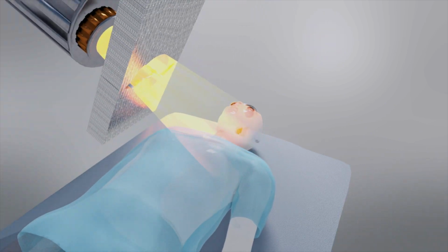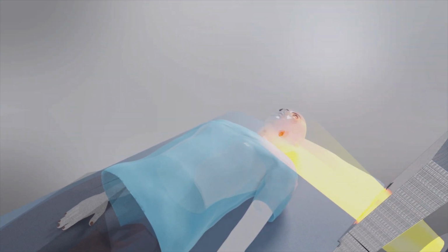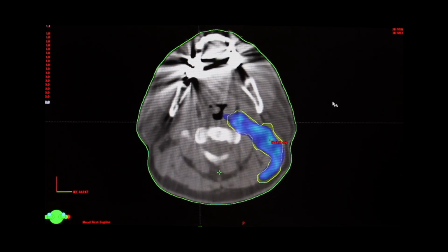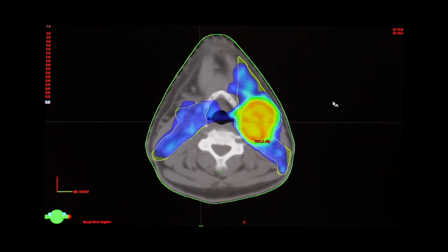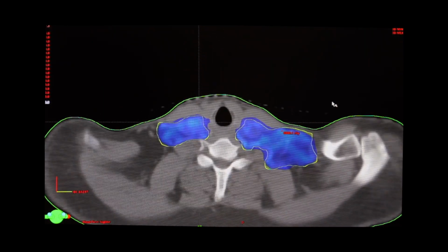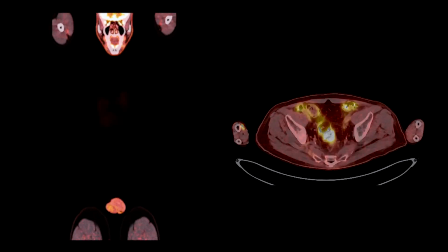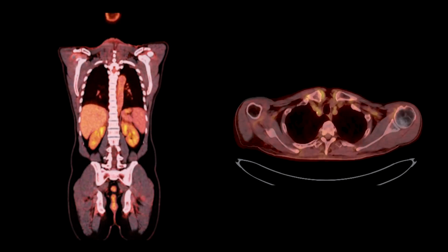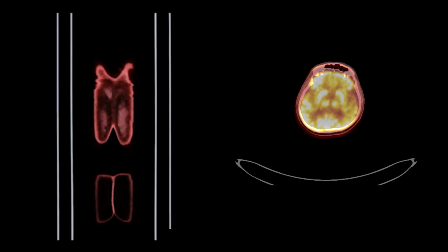After an initial consultation with a radiation oncologist, the following preparatory steps are taken to ready a patient for radiation treatment. Planning the areas to be treated by radiation is a process of outlining the anatomic extent of the tumor as well as areas of known or high potential for tumor spread. Endoscopy, biopsy, and imaging are typically used for this purpose.